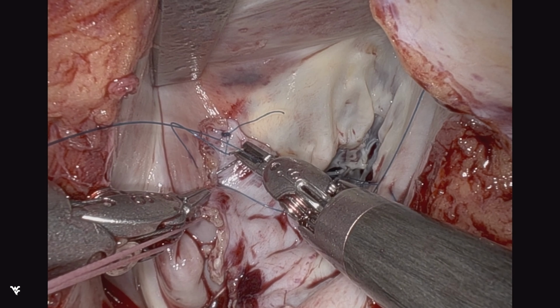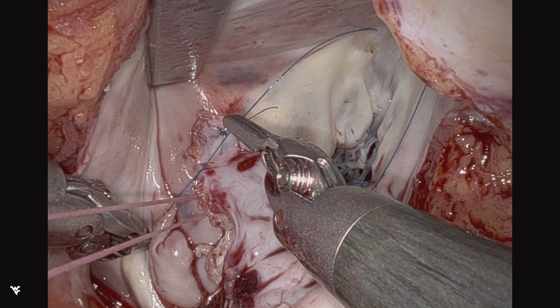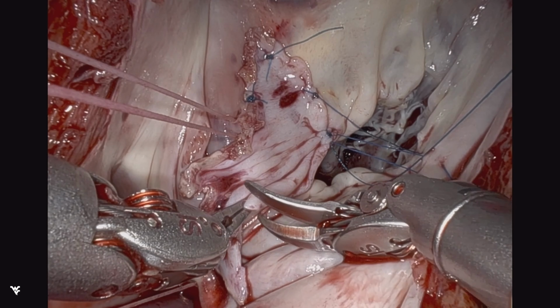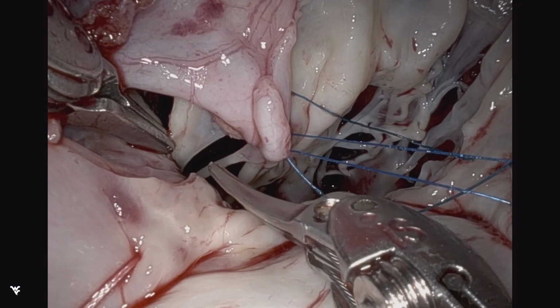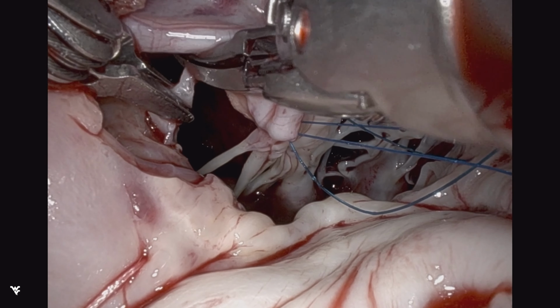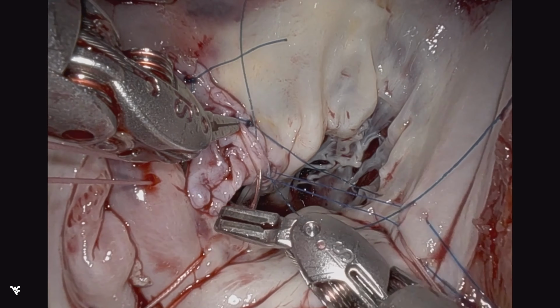Now, there is some trigone tissue slightly on the anterior leaflet side, which we will utilize to anchor our prosthesis or annuloplasty. Again, slightly oversizing the patch, because with each bite, the patch does shrink. But we did see a fairly robust secondary cord of the anterior leaflet.